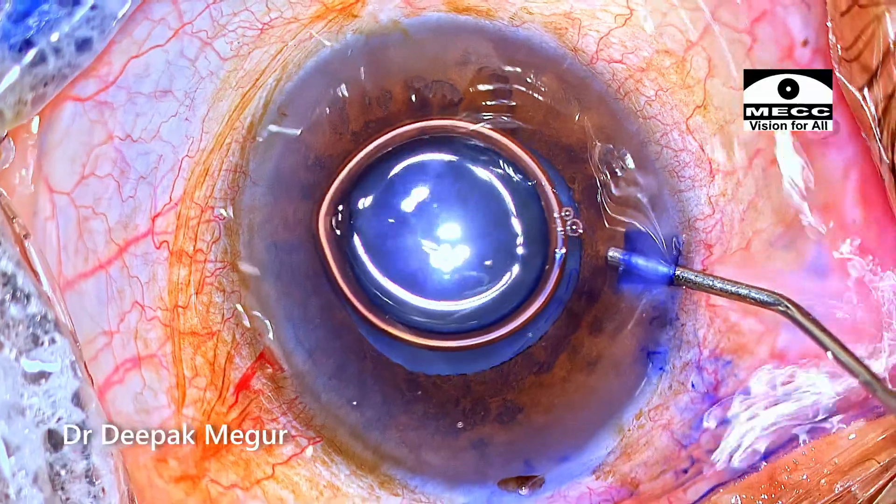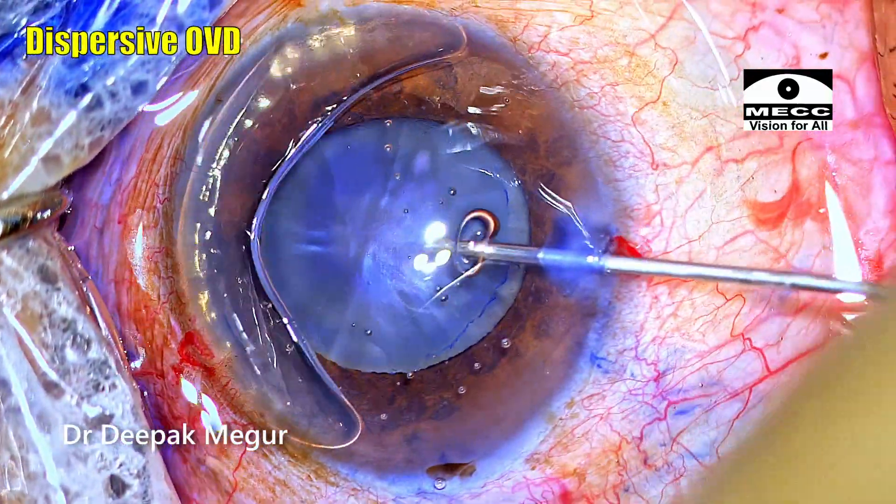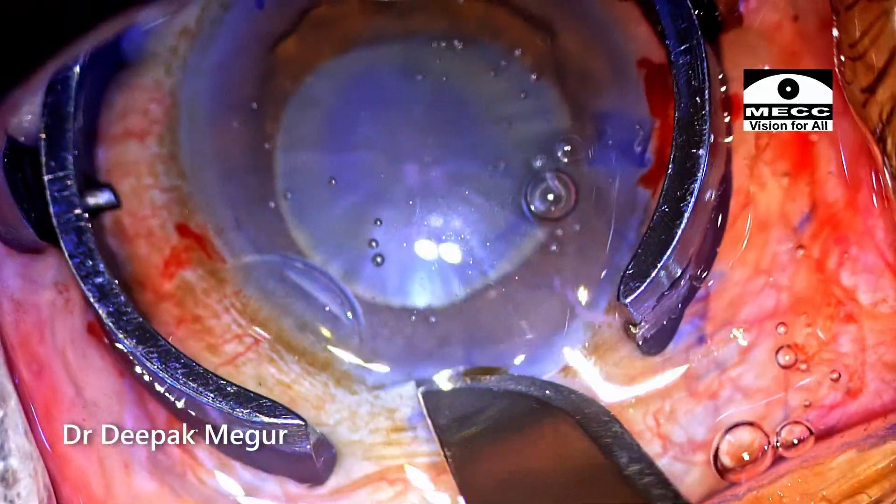This also helps maintain mydriasis well. I am using dispersive OVD to coat the endothelium. The main incision is created.